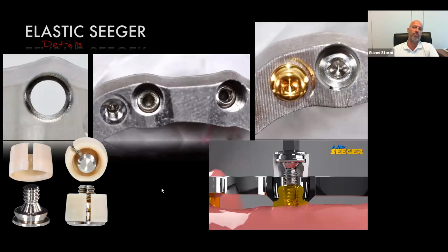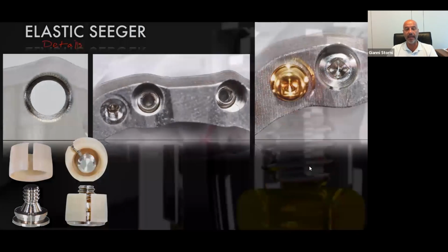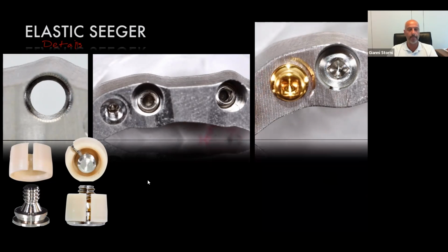Of course, if you're not making one very big mistake, but you can see here there is a bigger gap than here. This means that with one X, the bar doesn't fit. Using our system, yes. So that is one big advantage of the system.